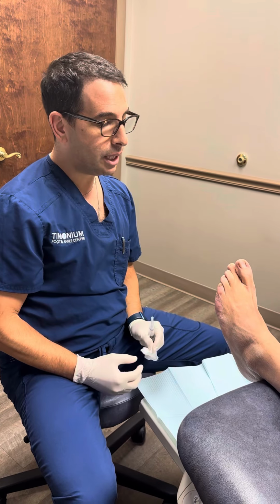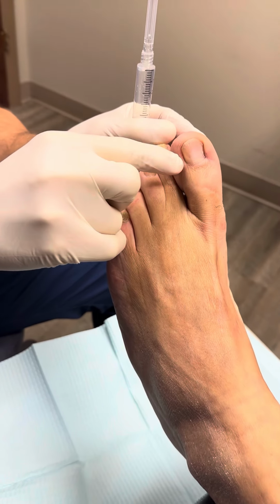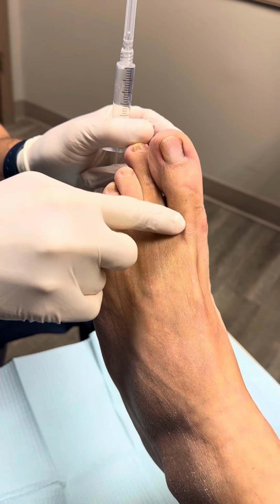And a nice patient has agreed to allow us to show how we do this. So come over here, and I want to show you, this is an ingrown nail. This nail corner is digging into the skin. I'm not going to push hard because it's very tender. And what we're going to do today is we're going to numb up his toe. We numb the toe back here at the base.